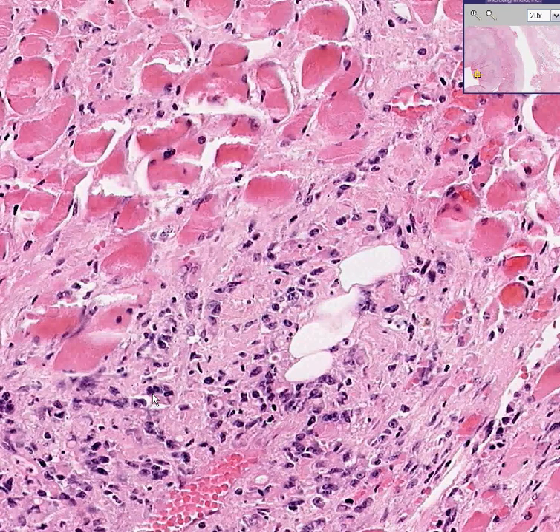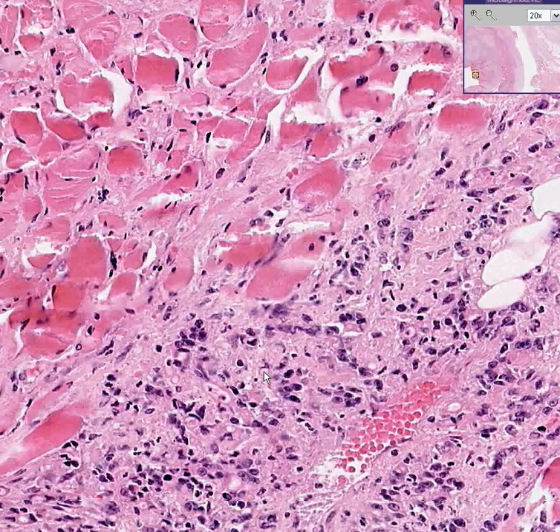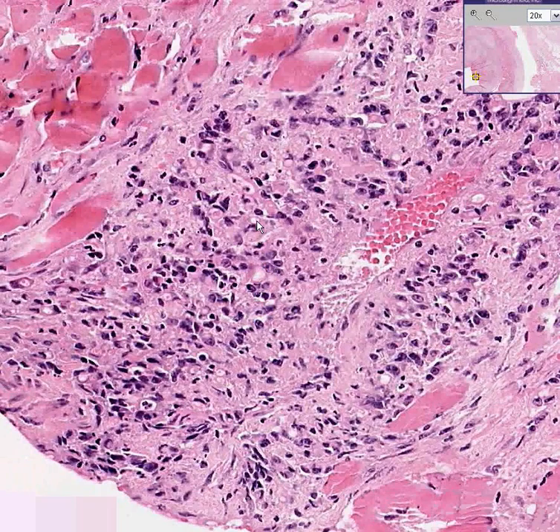And we could see that in some areas, like here, you could see a signet ring cell in which the nucleus is a little bit displaced. Let's find it again. Here we go. And the cytoplasm is filled with a mucinous type material. Here's another tumor cell, perhaps with the signet ring. Perhaps this is too. Perhaps this is too. But in some areas, the tumor cells form almost abortive type glandular formations.